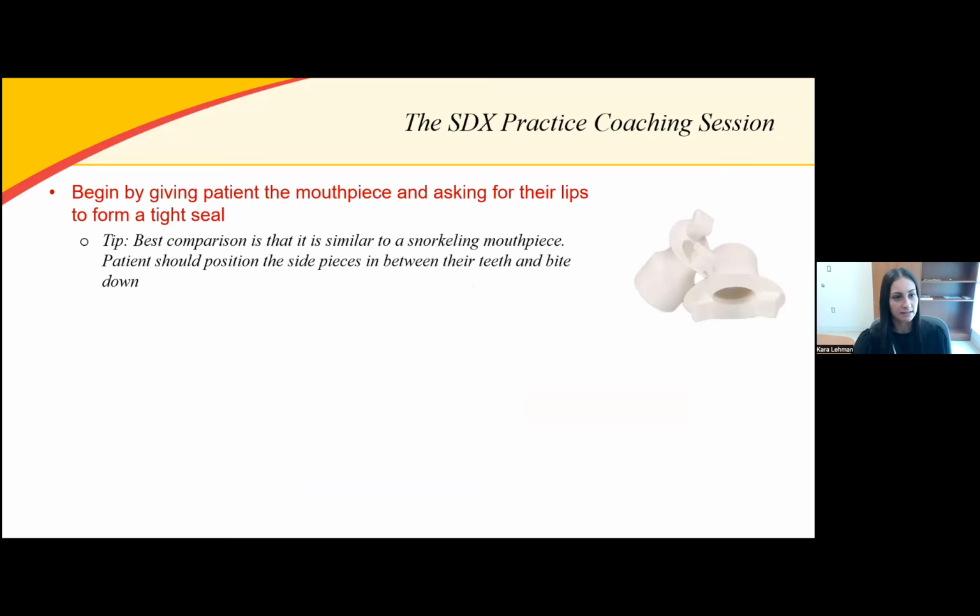Now, beginning the SDX practice coaching session, I think it's very important to make sure you explain all the components of the SDX equipment to your patients as best as possible. Otherwise, it just looks like a lot and they can become overwhelmed by all the equipment.